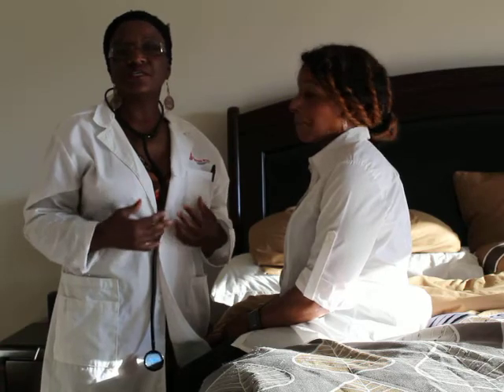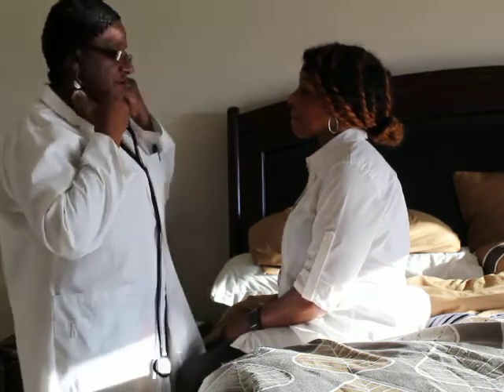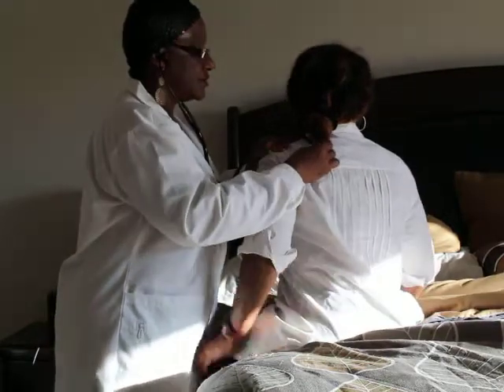That's what you're going to be hearing in the stethoscope when she says E. Okay? So I'm going to ask you, if you feel the stethoscope, I want you to keep saying E for me. So here we go.